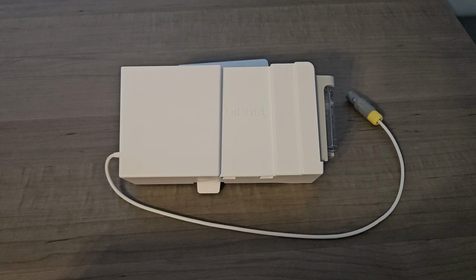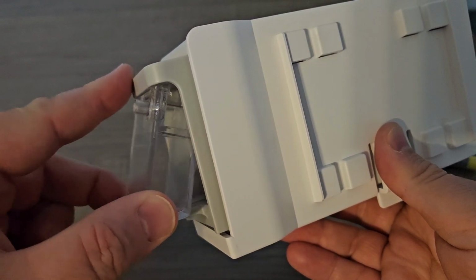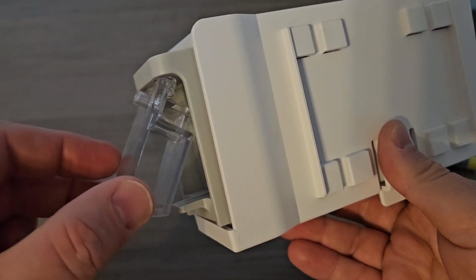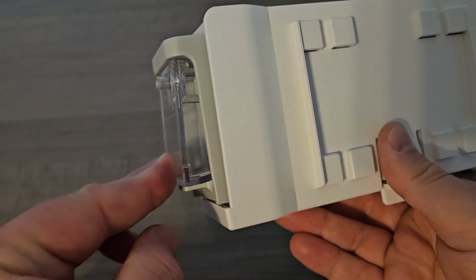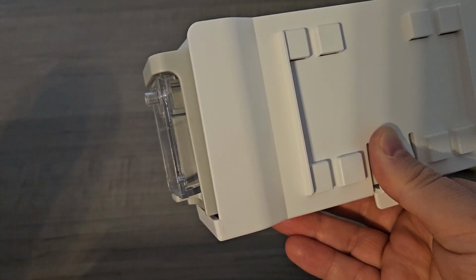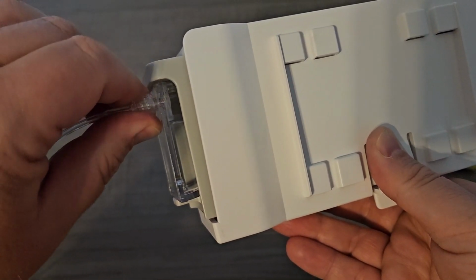The dual gas module is a multi-gas analyzer capable of a sidestream measurement of CO2 and one of 3 anesthetic agents: isoflurane, sevoflurane, and desflurane. To remove the water trap, pull the bottom of the water trap away from the unit. To install the water trap, place the two fittings in at a 45-degree angle and then push in from the bottom of the trap until a snap is heard. The airway adapter and sample line can be installed by plugging in and twisting.